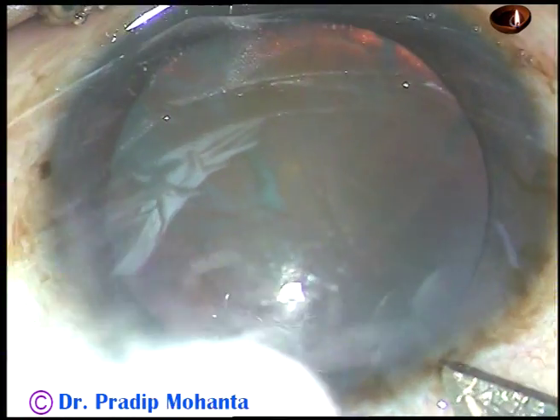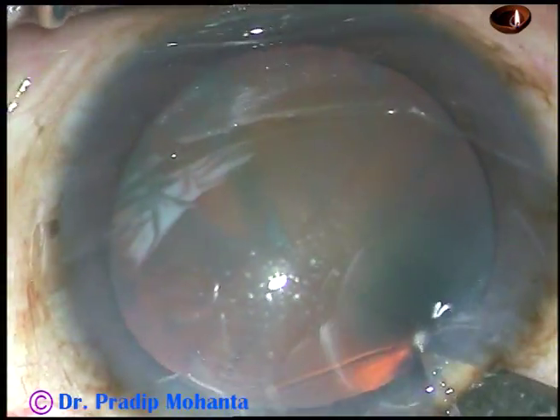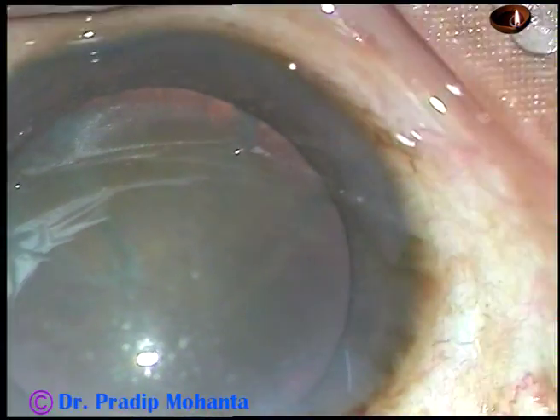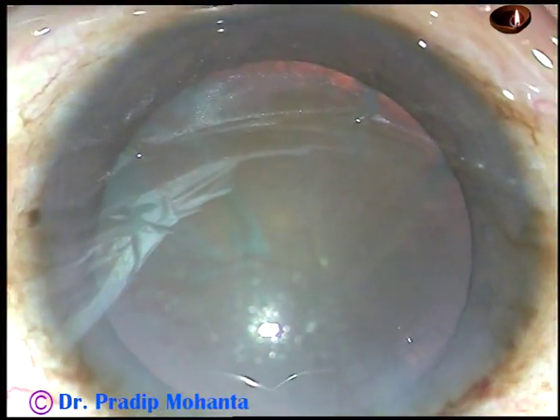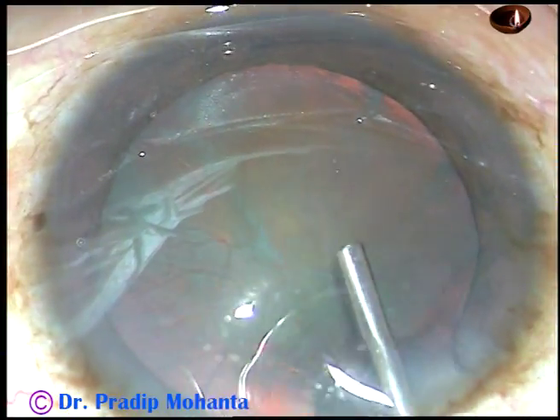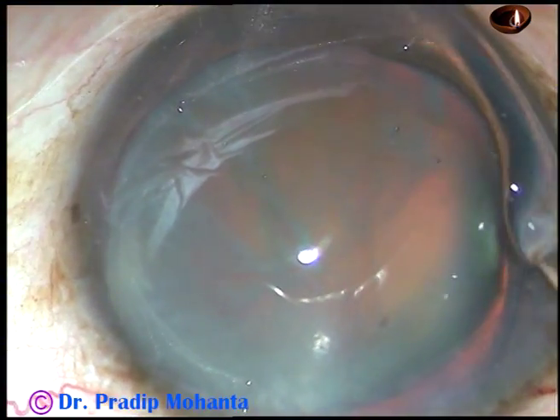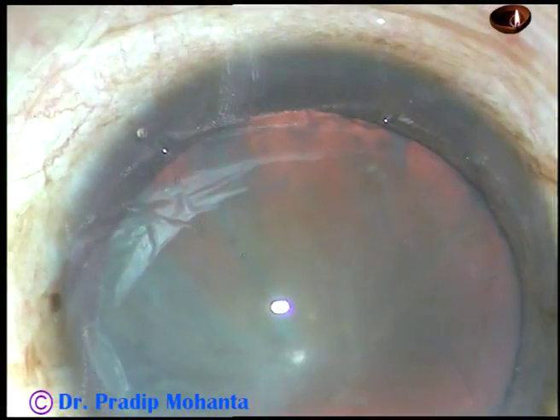This is the main incision with a 2.8 mm keratome on the posterior aspect of the limbus. Viscoelastic substance, 2% hydroxypropylmethylcellulose, is injected into the anterior chamber, and then it is sprayed over the corneal epithelium for better visibility and for protection of the corneal epithelium.